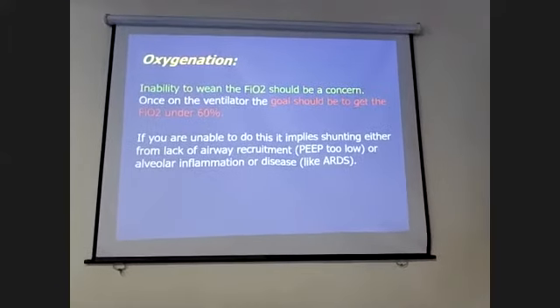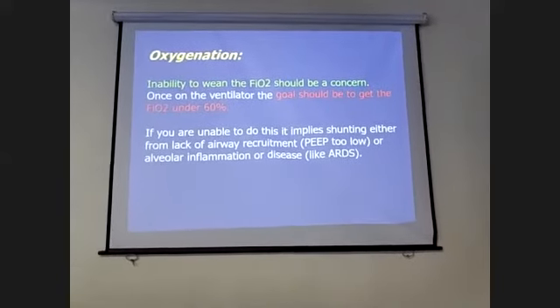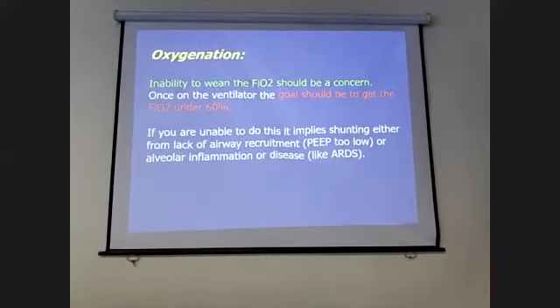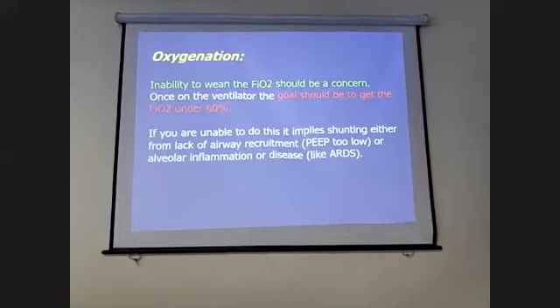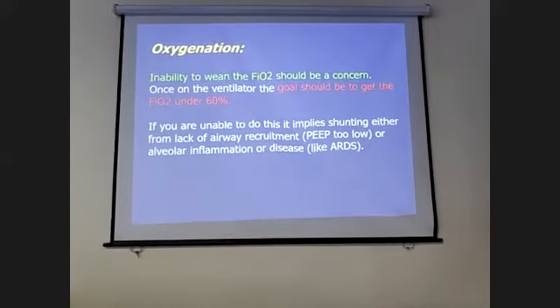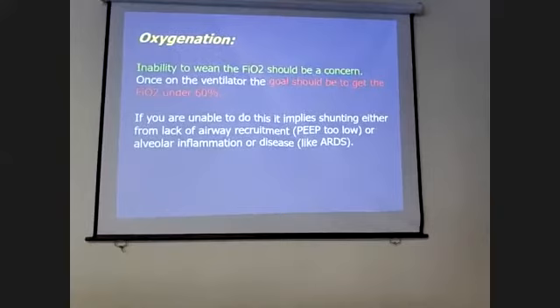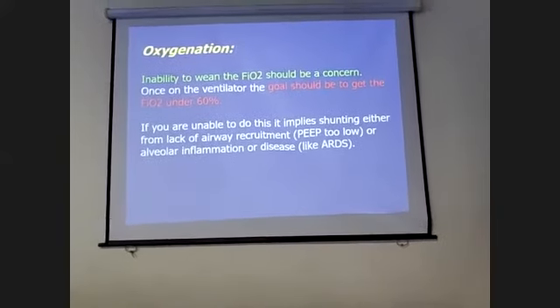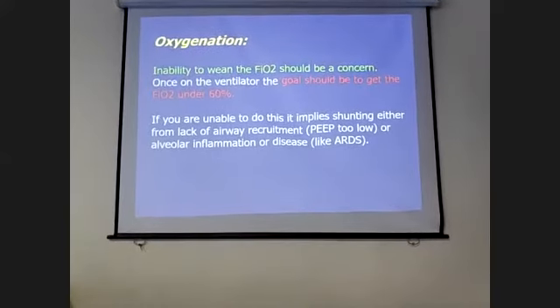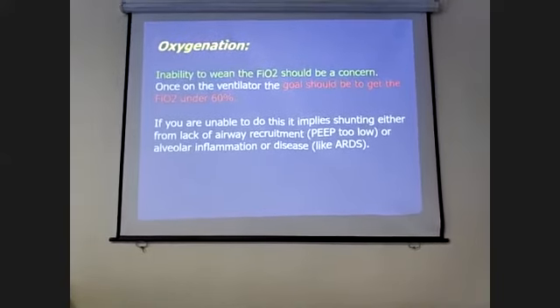Always remember that oxygen is toxic, especially when the patient's lungs are okay and you are giving an FiO2 that produces a PO2 going beyond 150. It is not the FiO2, it is the PO2 which is dangerous. So if the partial pressure of oxygen goes beyond 150, it is toxic. Up to 100 is the natural level which we maintain, but by supplementing oxygen, you can go up to 150.